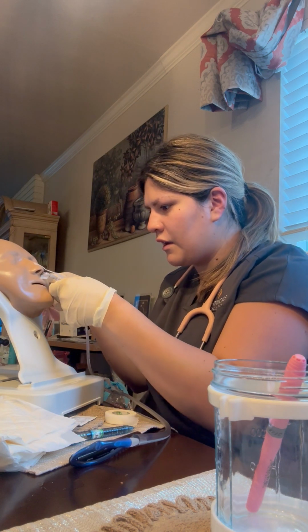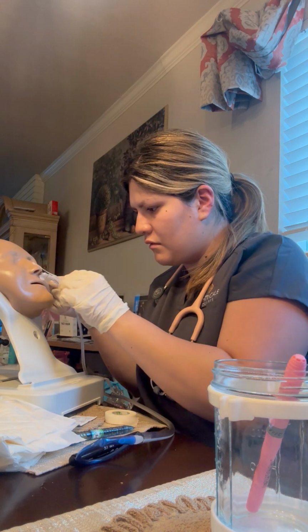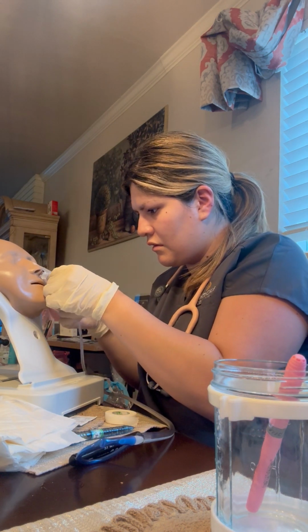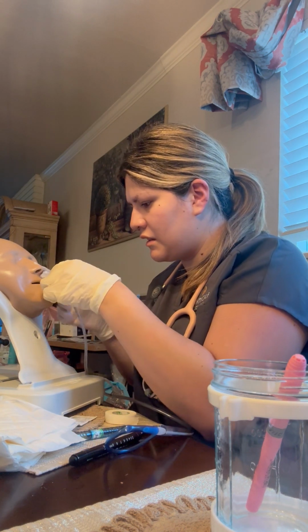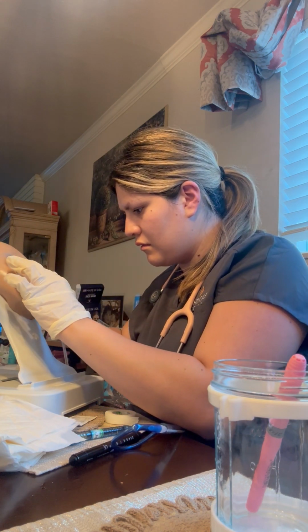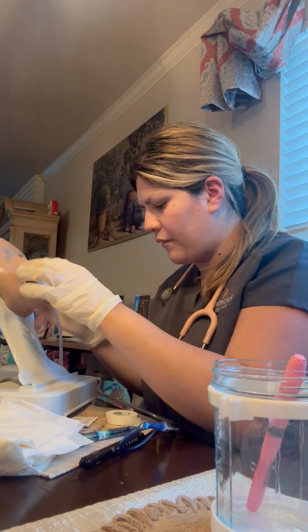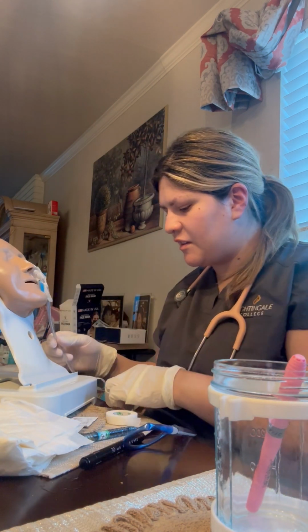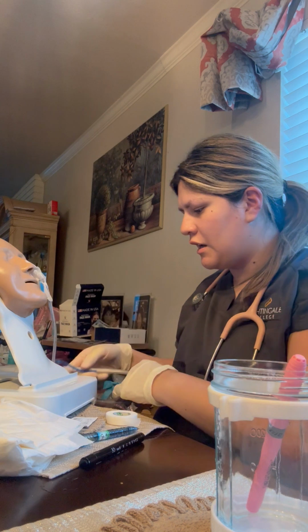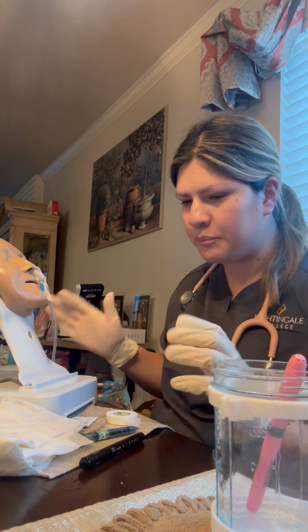Then you're going to go around. Okay. And then you would safety pin it to the gown. However, we don't have safety pins.